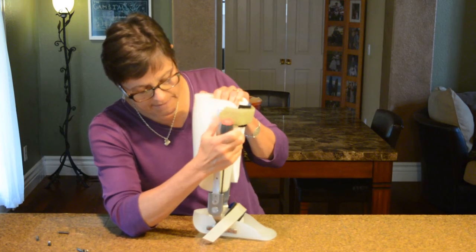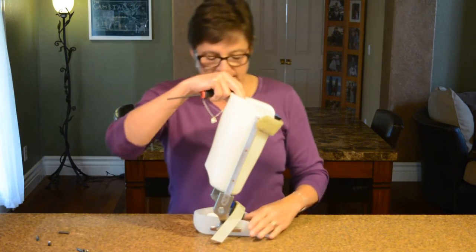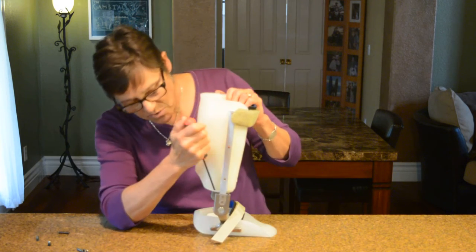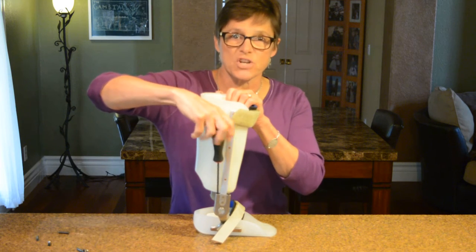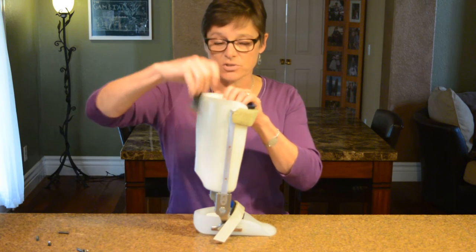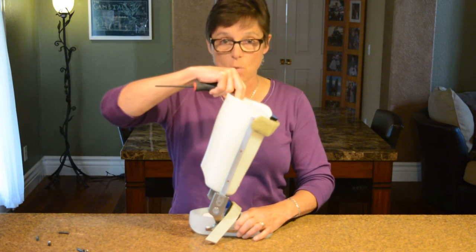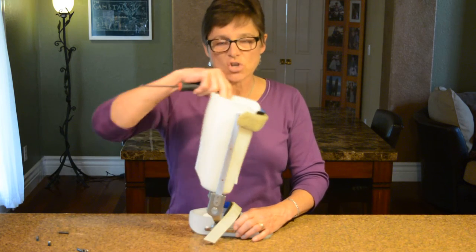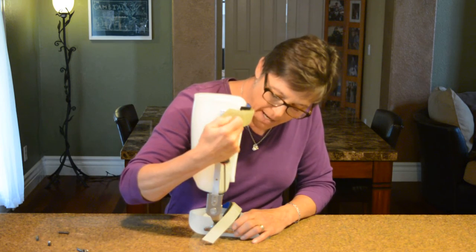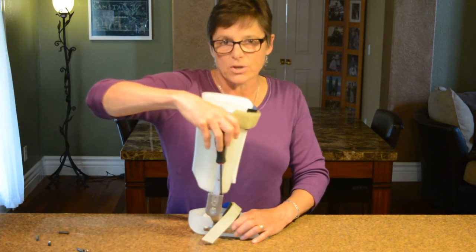Now the converse: I'll open that channel back up so we're free into dorsiflexion. But now if I want a plantar flexion stop — I don't want the brace coming past neutral — I tighten the posterior channel. That's referred to as a plantar flexion stop. This is terminology we all need to have under our belts. This brace now has a plantar flexion stop and open dorsiflexion to about 10 degrees.